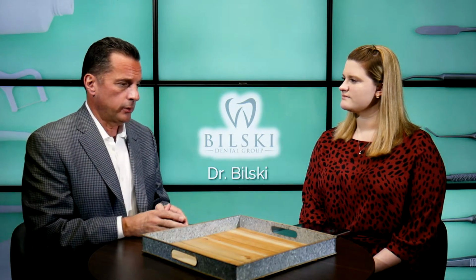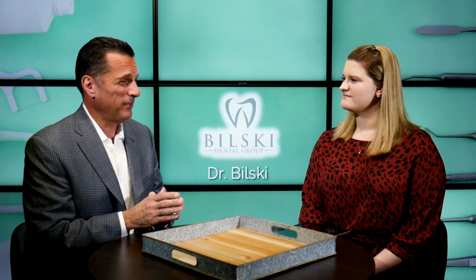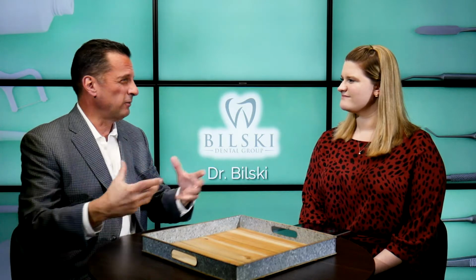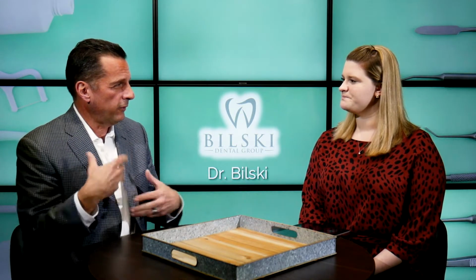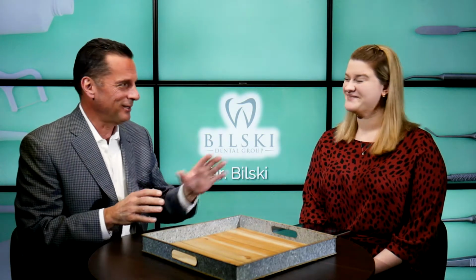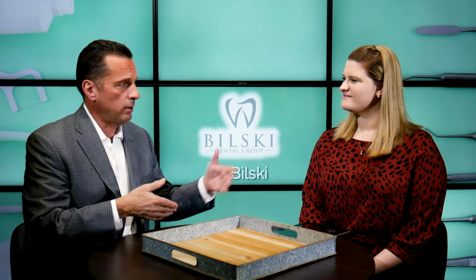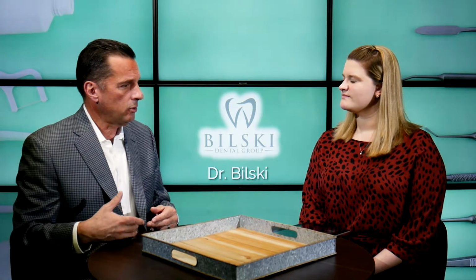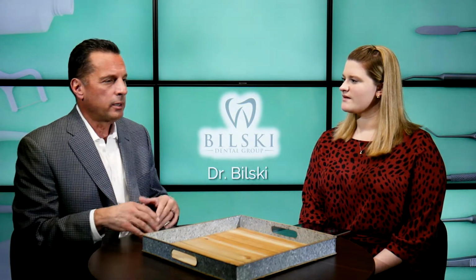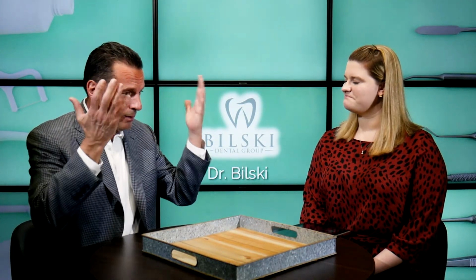What we know in laser dentistry and root canals is that you have to eliminate the endotoxins, the bacterial poop that is developed from the nerve dying or an infection that entered into the tooth. However it got there, that's not for this discussion. For another video. Exactly. So our technique is make an opening into the tooth after you're numb, clean out the inside of the tooth, reshaping it, and there's instrumentation, and picture a tornado or a sugar cone, ice cream cone. That's the shape we want to get in our brain.